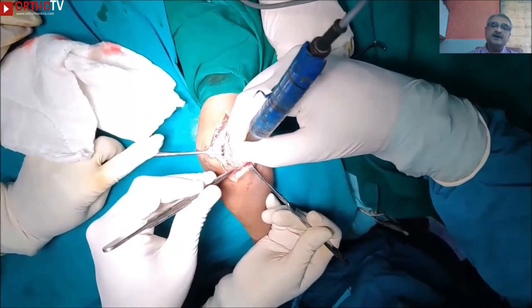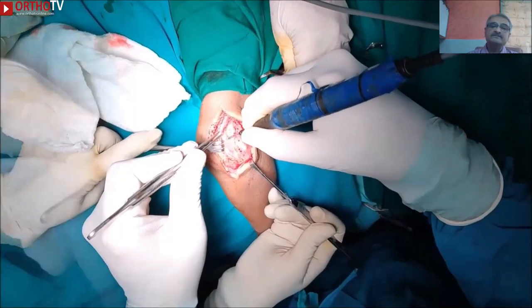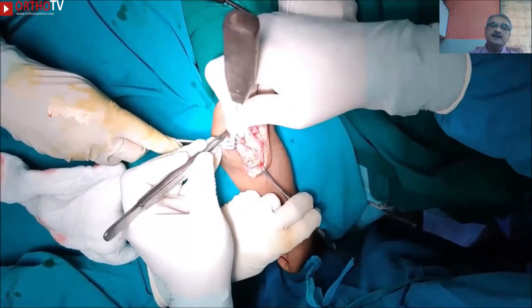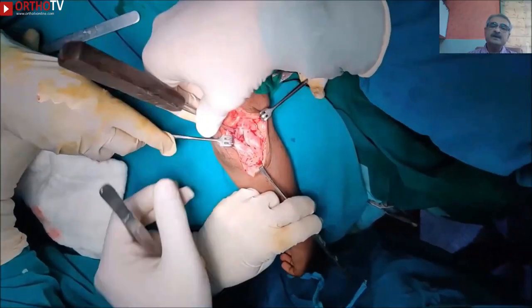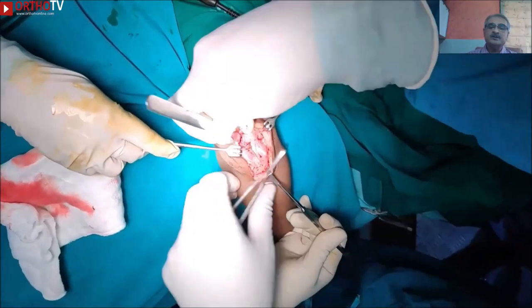Here I am incising the part of the triceps on the elbow joint. Subperiosteal dissection of the metaphyseal part is then done, and exposure is aided by placing a bone spike over the proximal fragment.